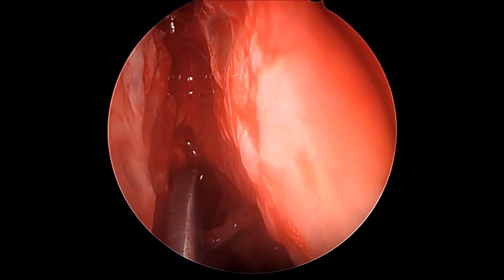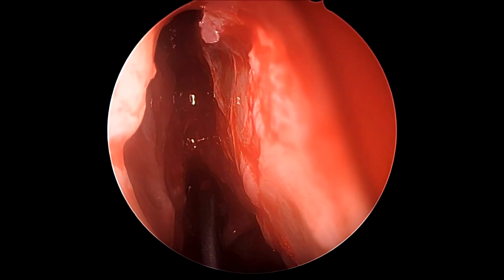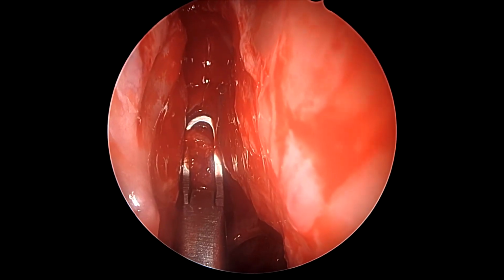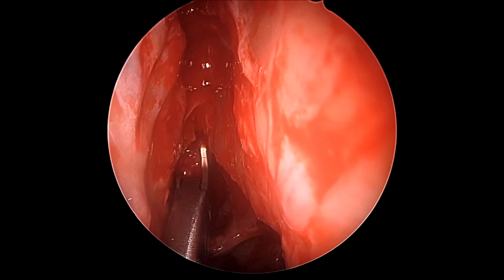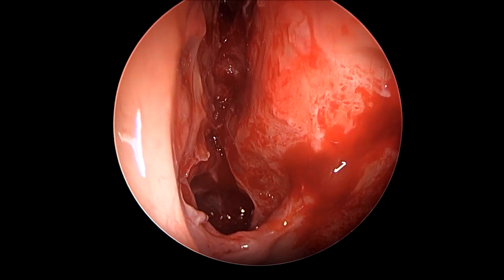And this is quite handy in removing most of the ethmoidal septations flush to the skull base, and to be able to make sure that the amount of excess bone and mucosa that could lead to polyp formation again in the ethmoids is reduced to a minimum.